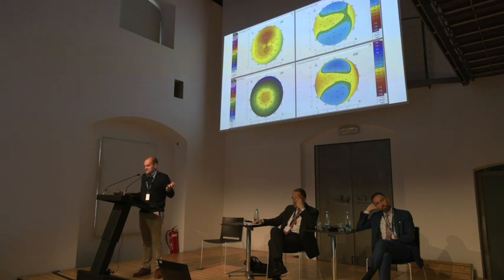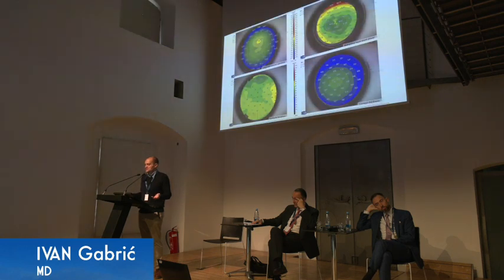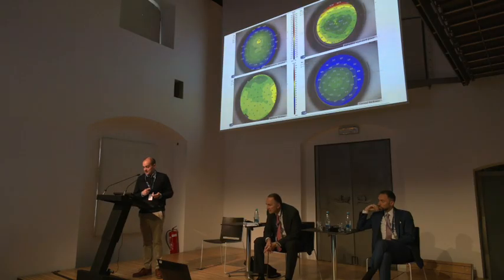Now, normal case. This is the standard view from the Pentacam. Everything looks great. And this is the standard view on the MS-39. The difference is, I actually trust this map. I actually trust what I see. And I get a beautiful epithelial map. I can tell this person has moderate dry eye because he's got some epithelial thickening in the base. I know he's good for refractive surgery. I don't have any issues. I don't even screen with Pentacam anymore.